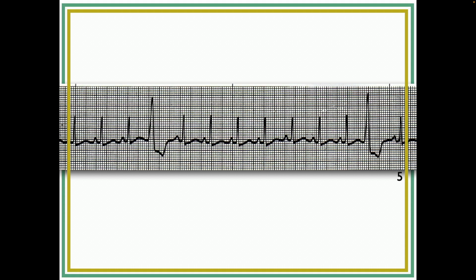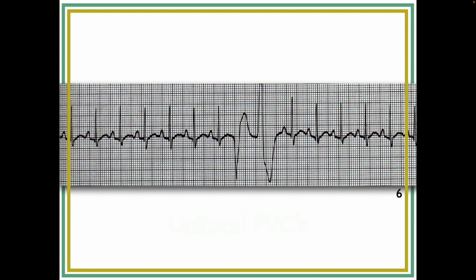So, let's see, Anne, we have two PVCs here. Are they unifocal or multifocal? They are unifocal, okay. And then, who's got the pointer? This one I want you to, okay, Grace. On this one, point out where the PVCs are. It's not immediately obvious. How many are there? Good, okay. And unifocal or multifocal?